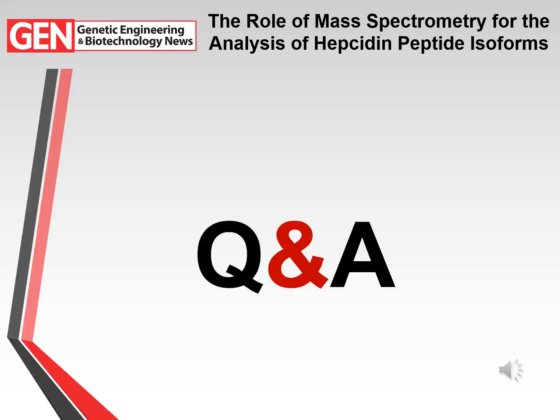The stickiness was a major thing, and so we went through lots of different materials, and as we go to very small volumes where we need to do some dilution, unfortunately fetal calf serum failed, but serum from other species that don't show interference is going to be very important. We need to have really robust, really fast methods so that the community at large can benefit from all of these advances.